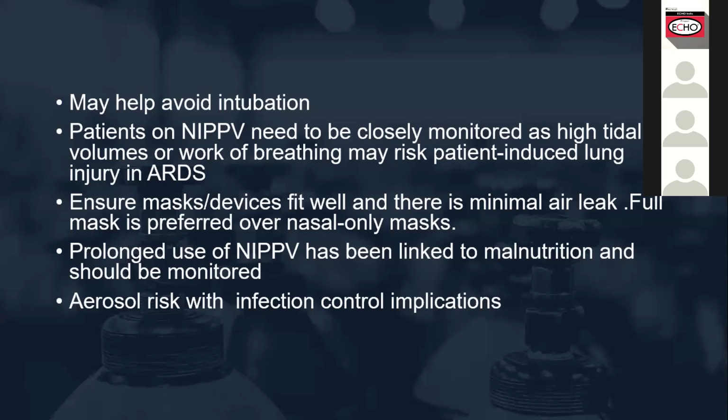ARDS. And you have to ensure that the masks are fitting well on the patient and there is no air leak. You have to prefer a full mask. Prolonged use of non-invasive positive pressure ventilation is linked with malnutrition, as there is a tendency to not interrupt this continuous delivery of pressure and to feed your patients.